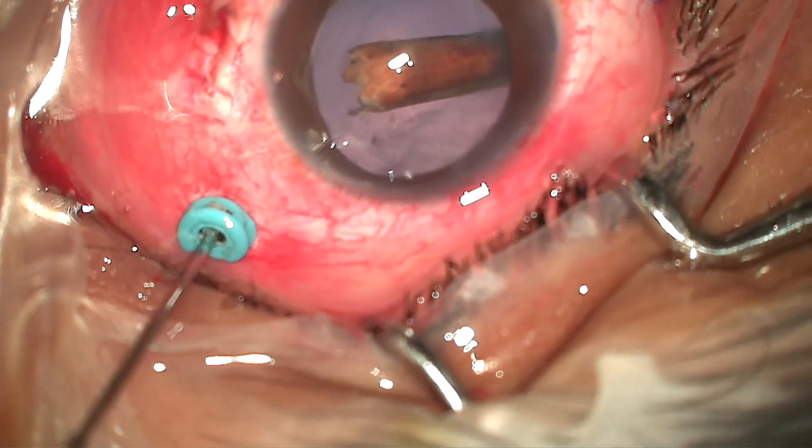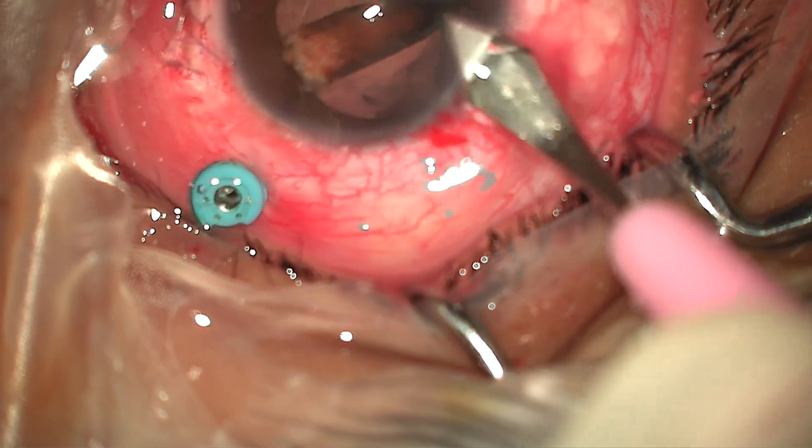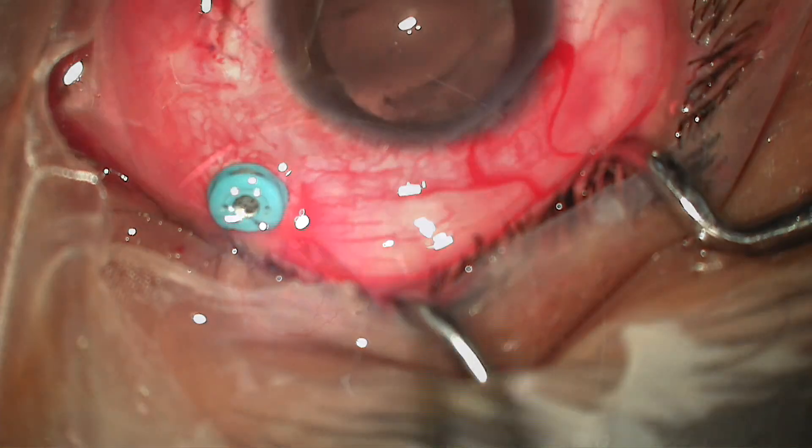I went in with max grip forceps, disengaged the non-metallic foreign body from the retina without prior laser to the area, brought the foreign body anteriorly, enlarged the corneal incision, but could not hold onto the large foreign body with max grip forceps.